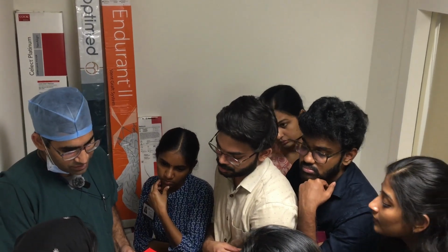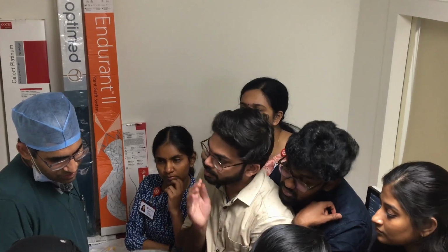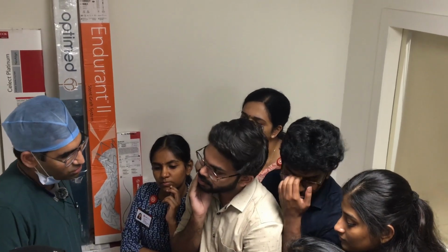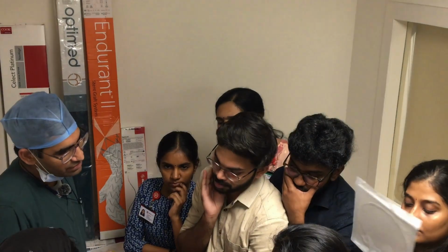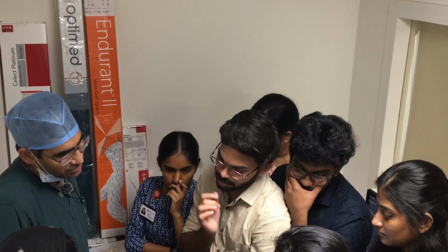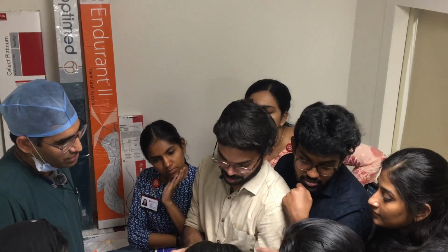You can open it. This is a Mustang. This way, with the rapid exchange, the advantage is you can work with a smaller wire, and you can do things relatively faster. Okay. The disadvantage is pushability suffers a little bit.